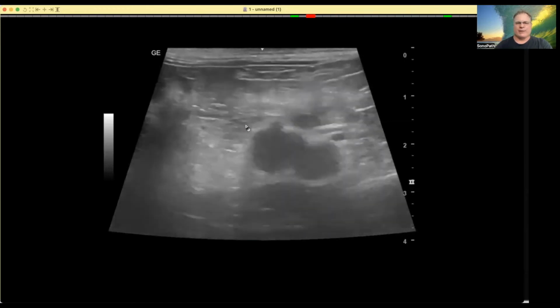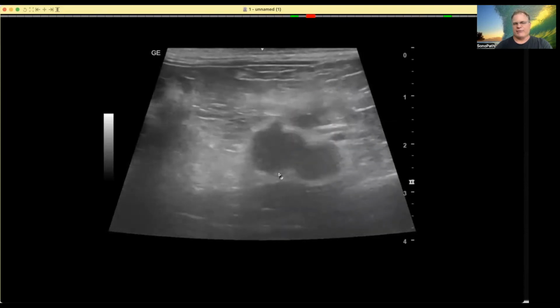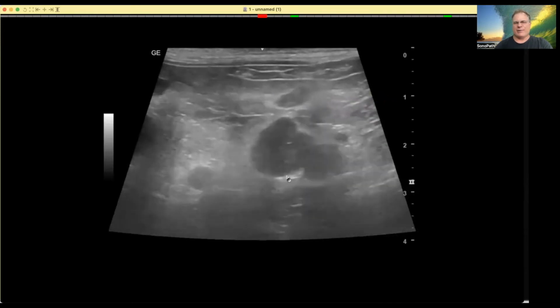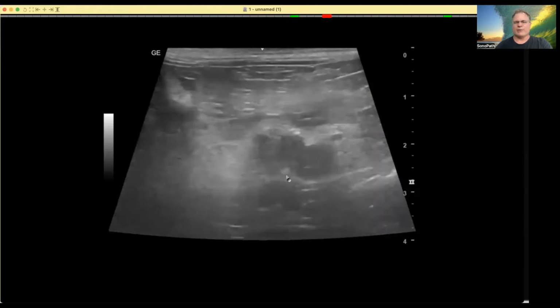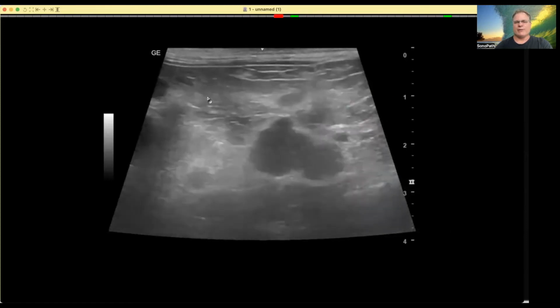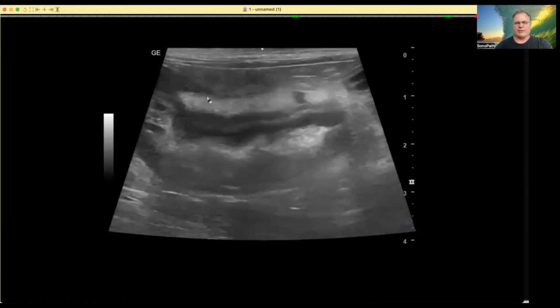The other thing we see are regional lymph nodes that are distorted. Now, typically lymph nodes that are longer than they are wide and kind of look like an egg are reactive. However, these are starting to expand and create irregular contour. When that happens, you have to think of at least aggressive lymphadenitis, if not emerging round cell neoplasia, or carcinoma mets or something along those lines. But we also have all this reactive mesentery, and this is all localized peritonitis. There's a little bit of free fluid here, so definitely there's some heat going on regarding pathology.